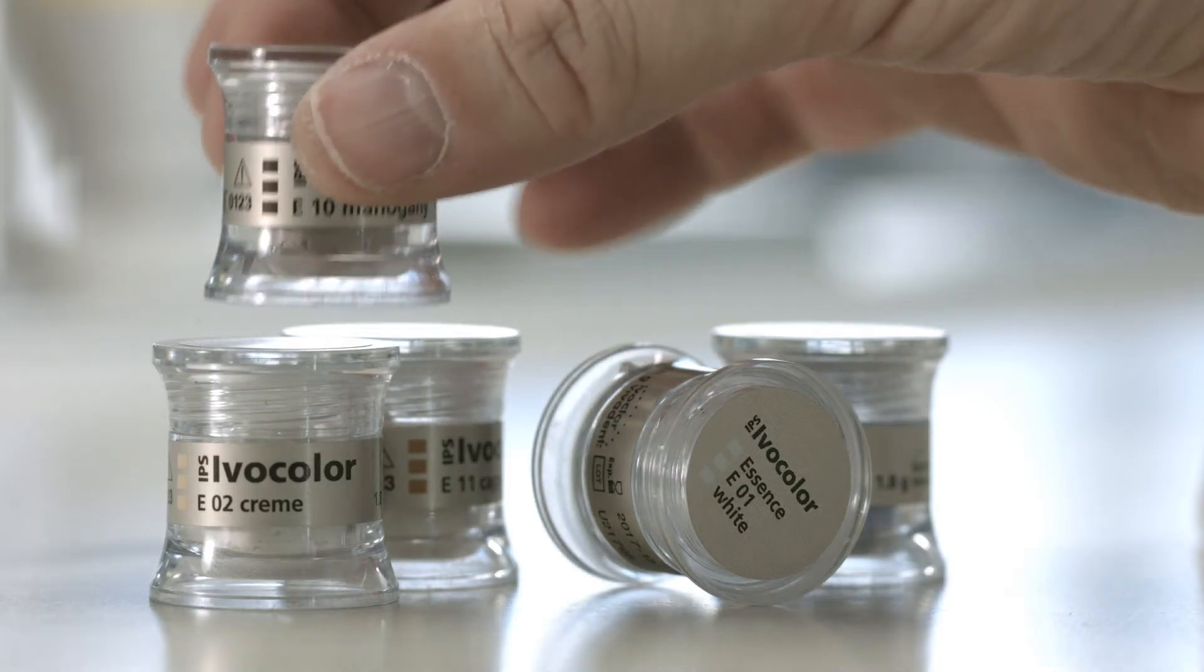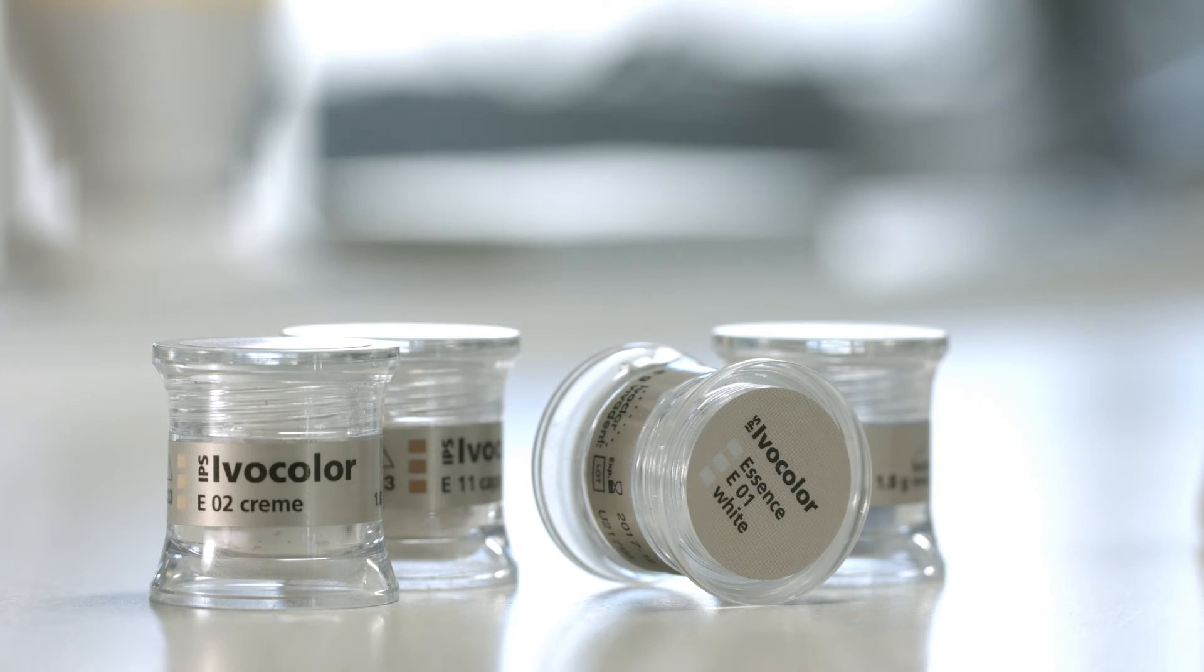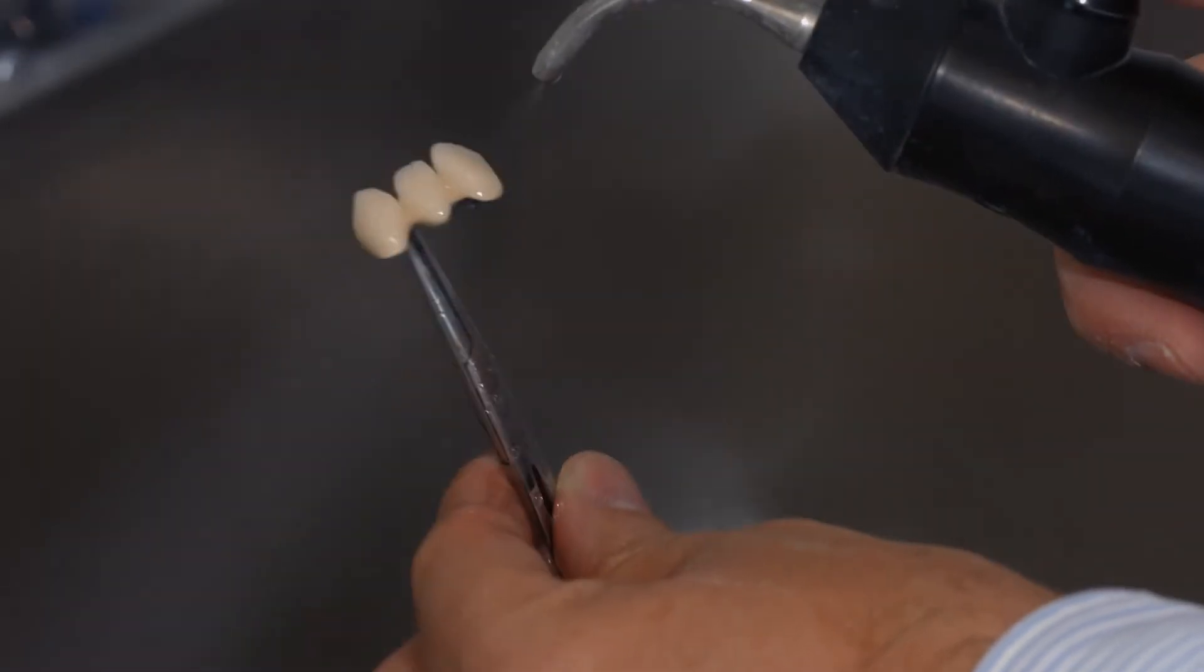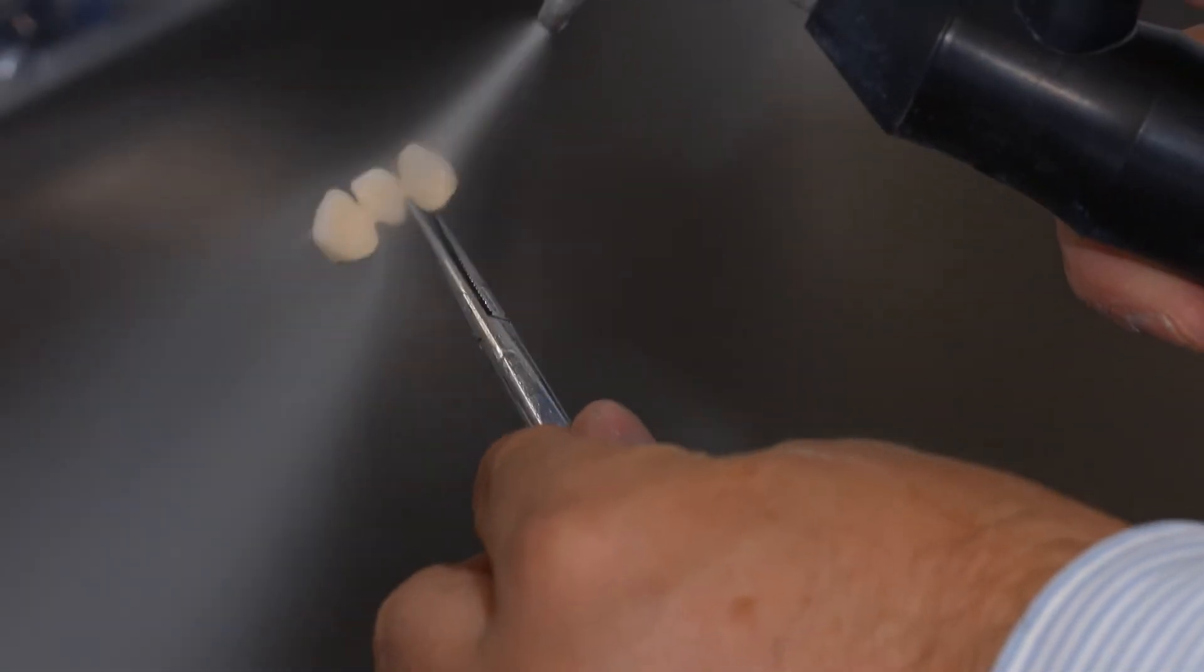Individualized characteristics can be applied with IPS Ivocolor Essence powders. In preparation for this process, thoroughly clean the restoration with the steam jet and dry it with oil-free air.